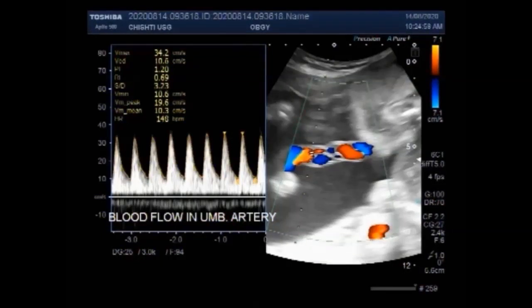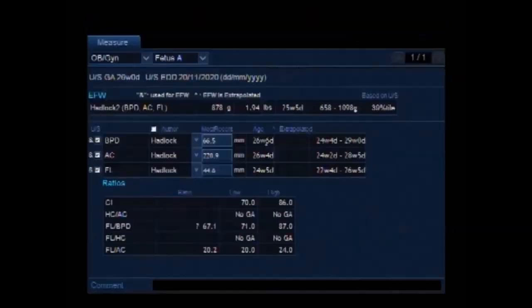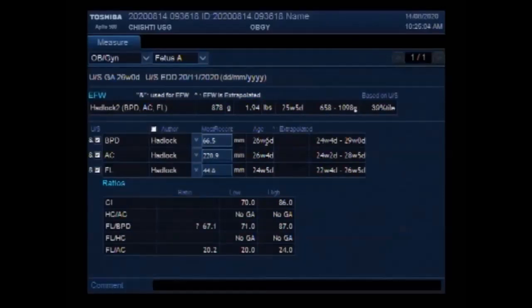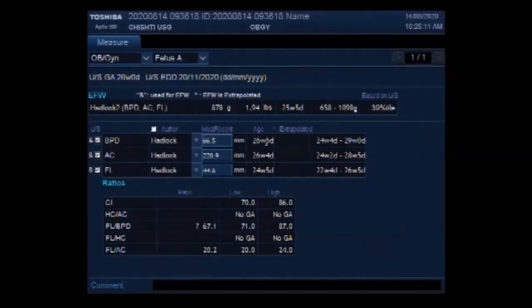Dear viewers, I hope you are all fine. This ultrasound video shows a case of hydrops fetalis, with soft tissue edema and fetal pleural findings. The duration of the pregnancy is about 26 weeks.